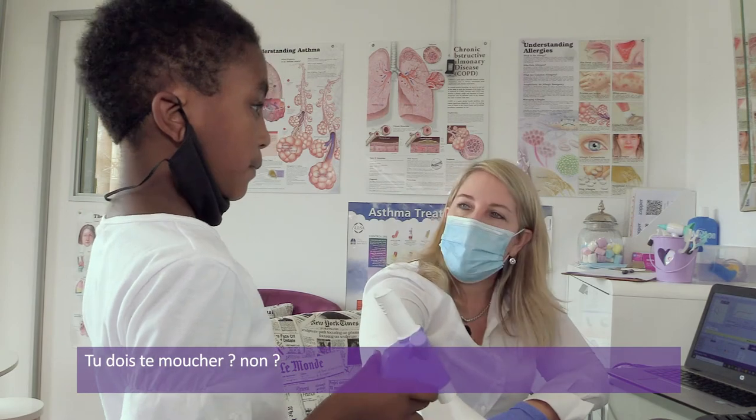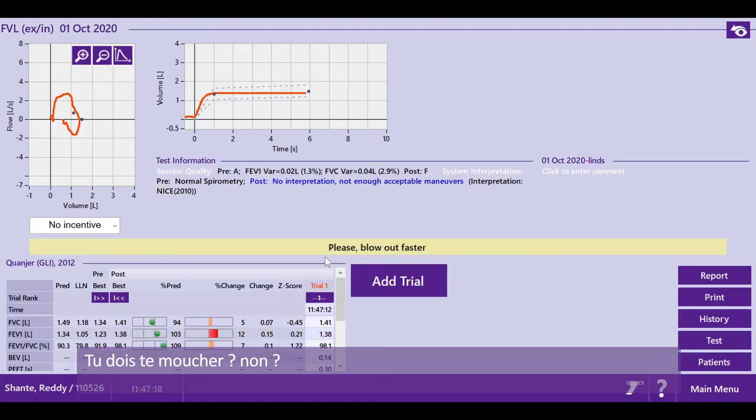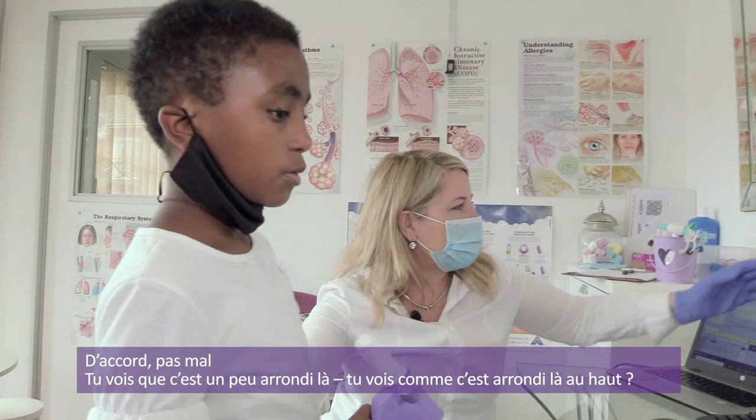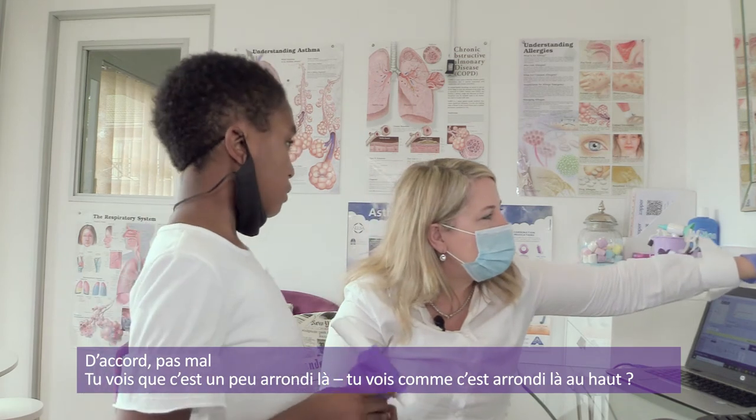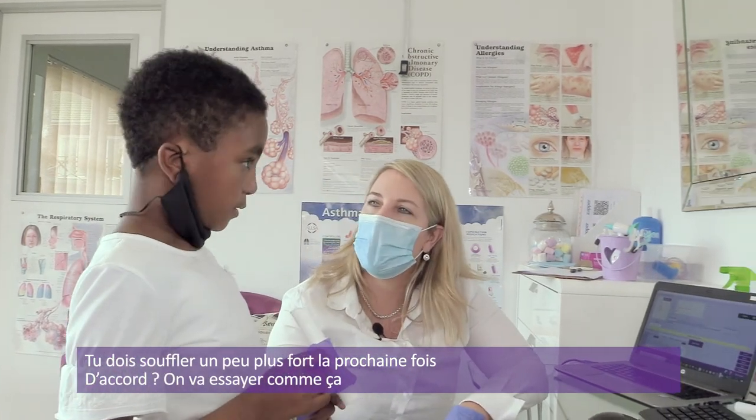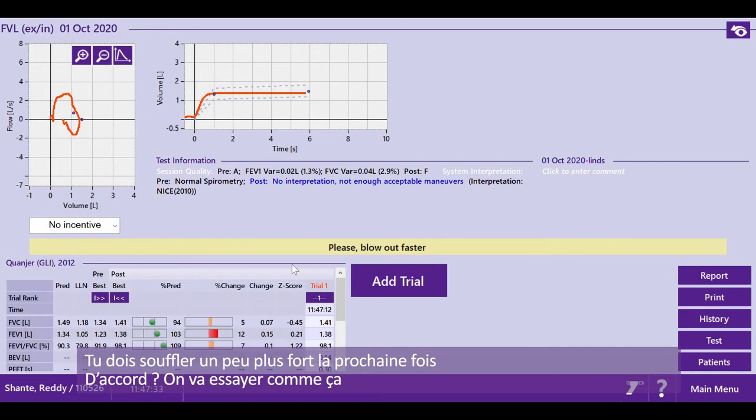Okay. Do you need to blow your nose at all? All right. Okay, not too bad. You can see it's a little bit rounded there. Okay, just move a little bit this way. Okay, come look here. So you see how round it is there at the top. You need to blow a little bit faster on your next blow. Okay, let's give that a try.